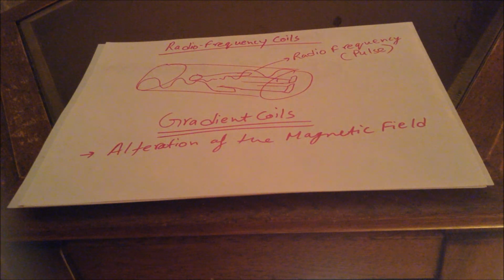But what is the purpose of doing that? By doing that, those atoms emit energy absorbed from the pulse. Once the pulse stops, those atoms spin and emit energy, and then the MRI device sends a regular repeating radio frequency pulse, which causes those hydrogen atoms to produce regular energy signals, which are detected by the receivers.